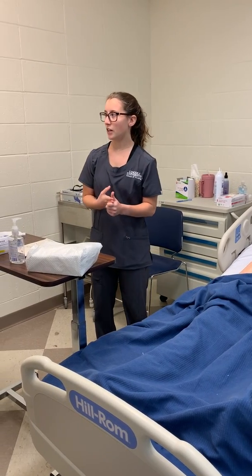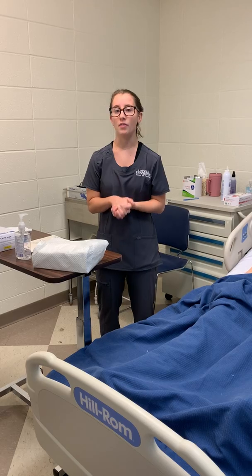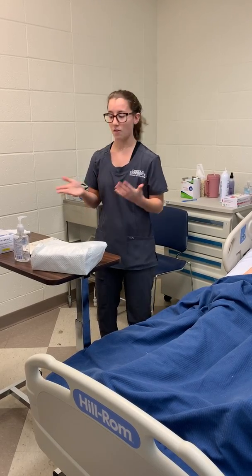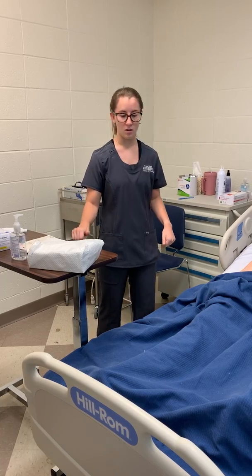So the first thing I've done is I've assessed my patient's condition, the order for the catheter, and the size of the catheter, and I've also assessed when their last void time was. I've also gathered all my equipment here, so now I'm going to go ahead and go into the room.